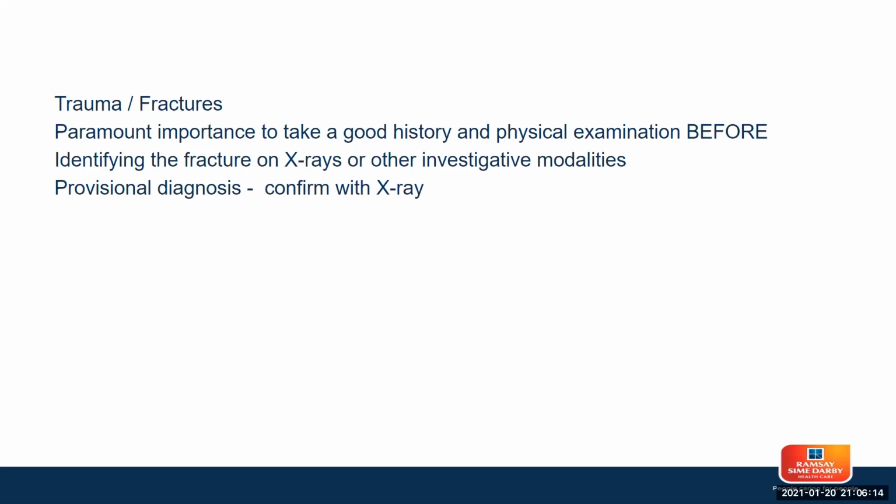So don't rely 100% on X-rays, because sometimes, especially now, people send X-rays over the phone and ask your boss, what do you think about this and that, on WhatsApp and all that. And things can easily go wrong. Things can be missed. Fractures can be missed, wrongly identified. A lot of things can go wrong. So just be very, very careful when you're dealing with X-rays.